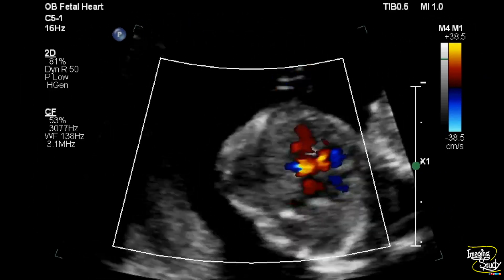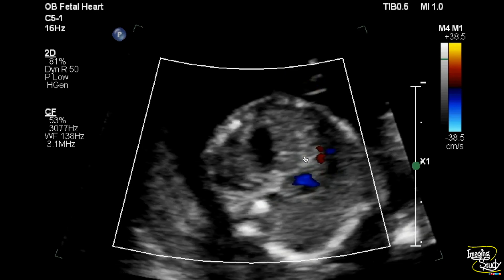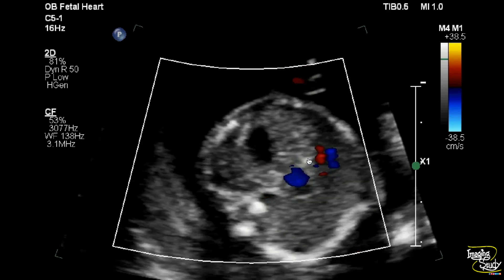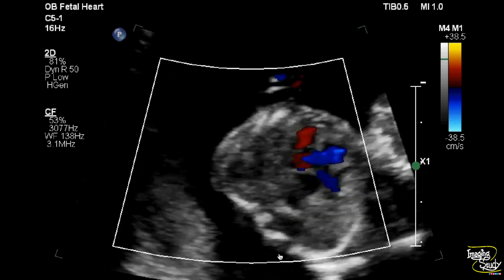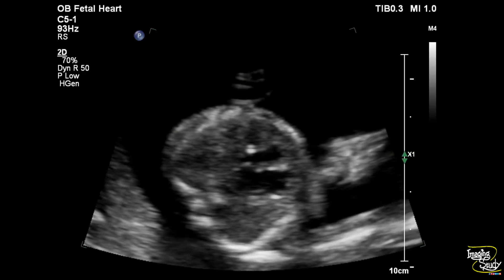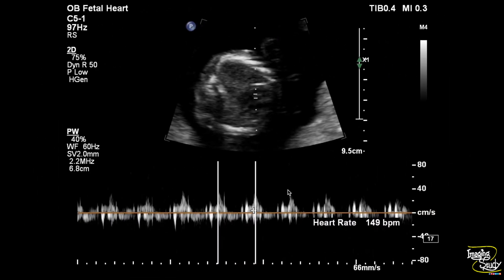Here is the color Doppler picture and you can see that with normal intracardiac flow, this ecogenic focus is still visualized. The heart rate was within normal limits, around 149 beats per minute, with a regular rhythm.